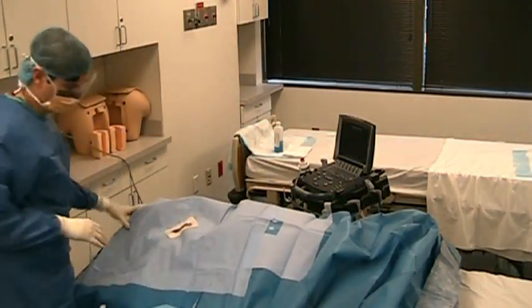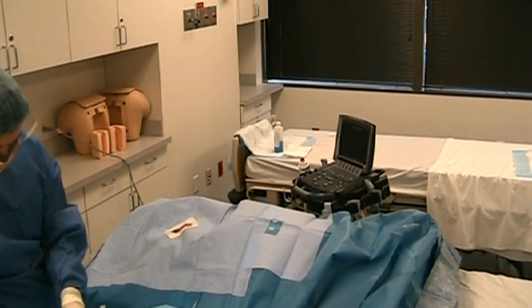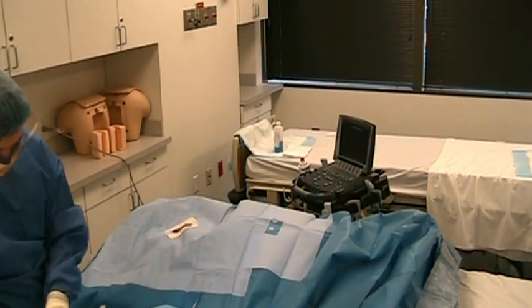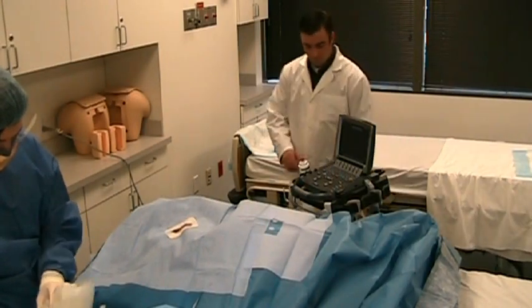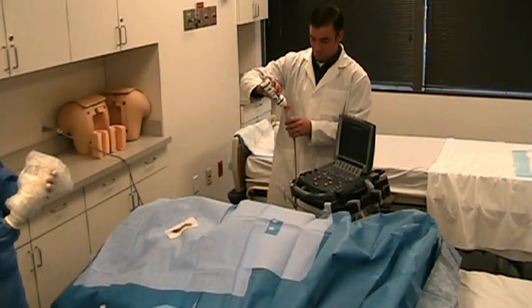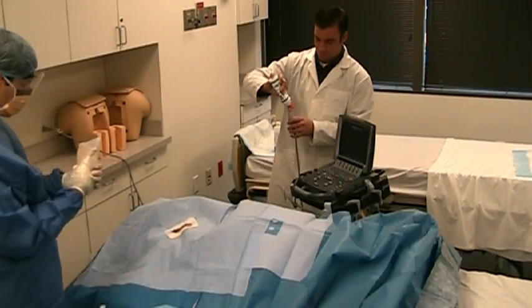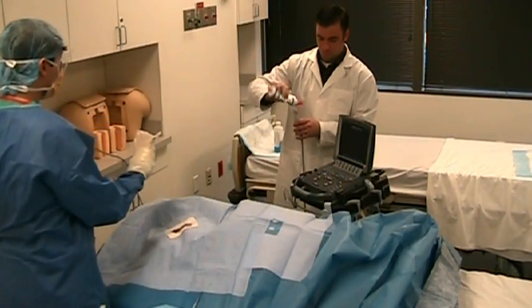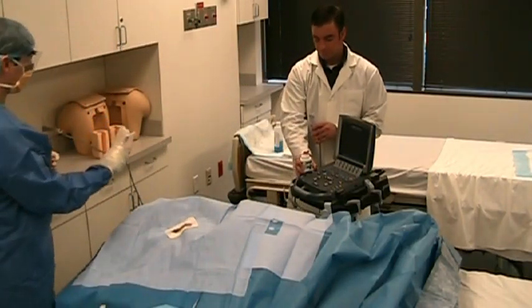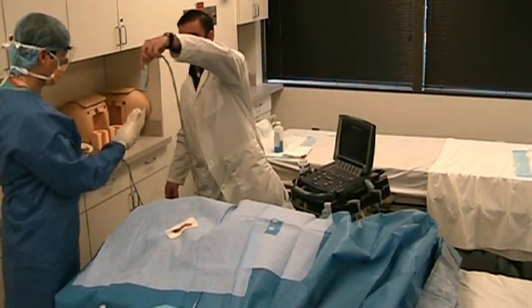The assistant applies gel to the end of the ultrasound probe. The probe is inserted inside the probe cover. Special attention is taken to ensure the outside of the cover remains sterile.